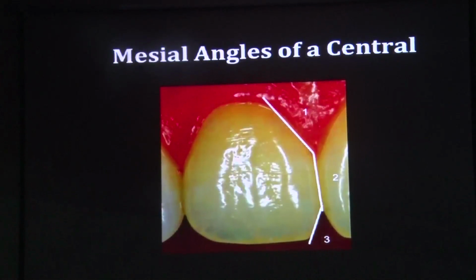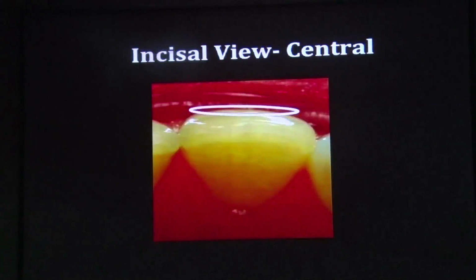You know what is the most common mistake when they do diastema closure? They don't think about these angles. They place the composite straight. So then that composite always hits this papilla, and that papilla is always inflamed and red. Right? So this is a key point. Then comes your developmental depression.